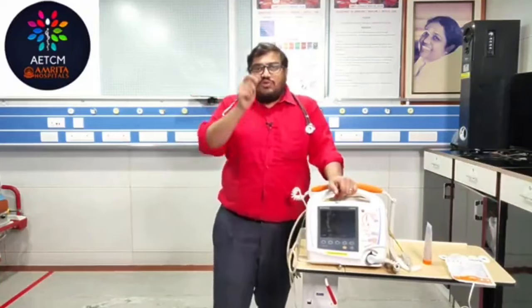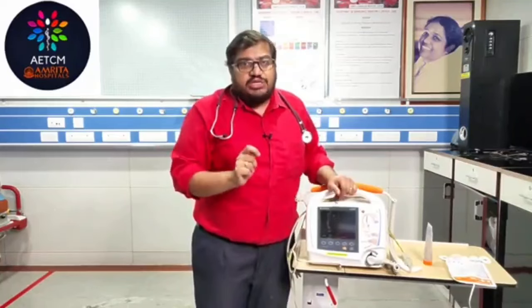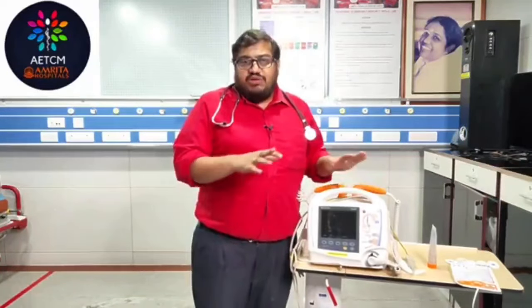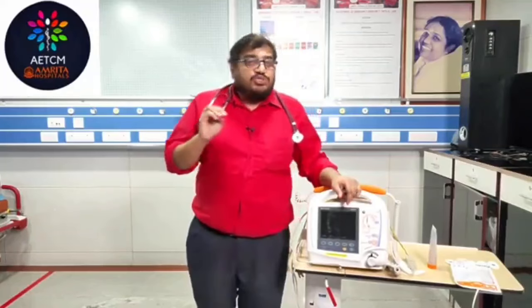So already he is having an arrhythmia. On top of that, the heart will be in a refractory phase when you are not selecting the synchronization. So it's very important when you are going for a cardioversion, always remember to do it as a synchronized cardioversion. I will show you the device and synchronized cardioversion. So this is basically the difference between a defibrillation and cardioversion, and the mechanism is the same, everything is the same. Now we will see the procedure in detail.